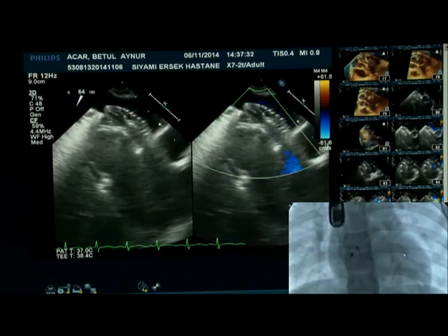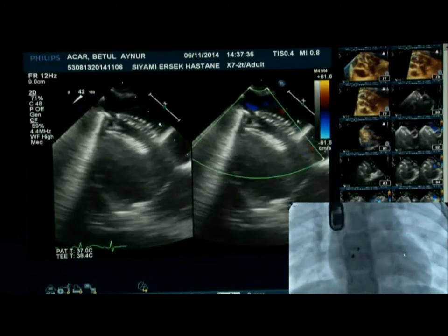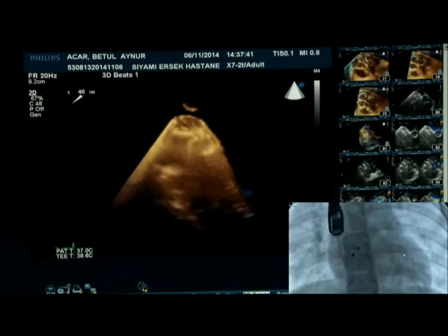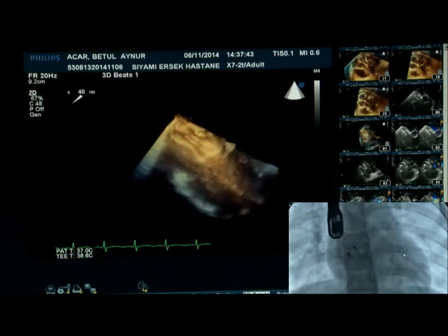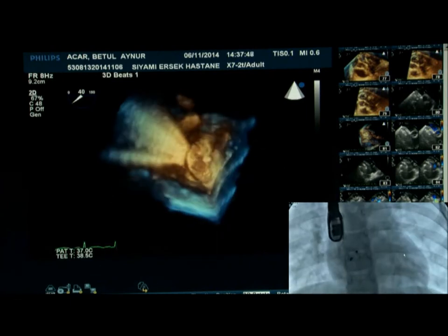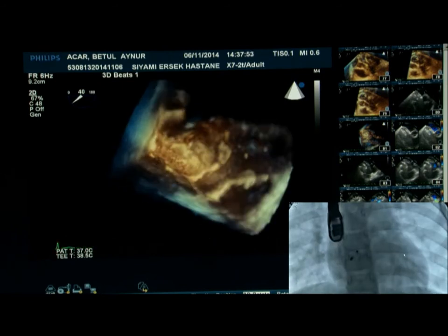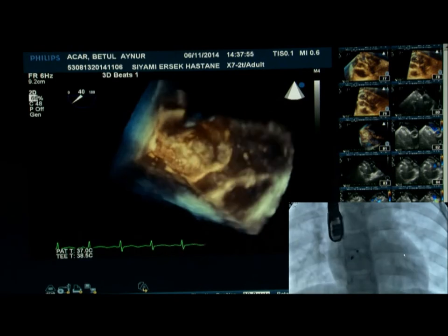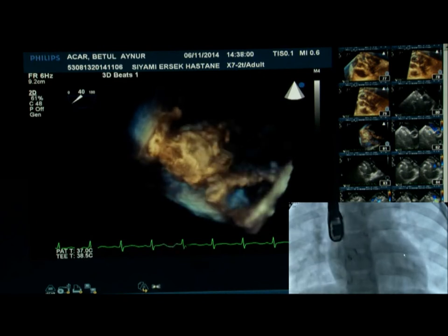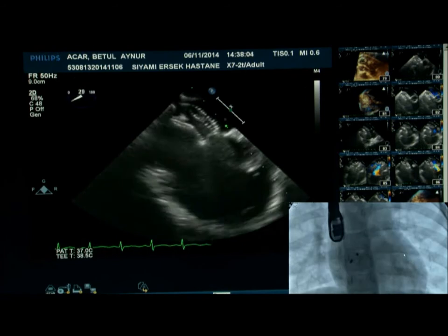Yeah, Shaq Mansour. Just a question. If you use a cribriform device in this patient, probably it will have a better profile. Probably the right disc and left disc will approach each other in a better way, and probably you don't need to bother to come through the larger defect as long as you are central within the atrial septum. Yeah. Well, that's a very good suggestion. We discussed the cribriform device here as well.